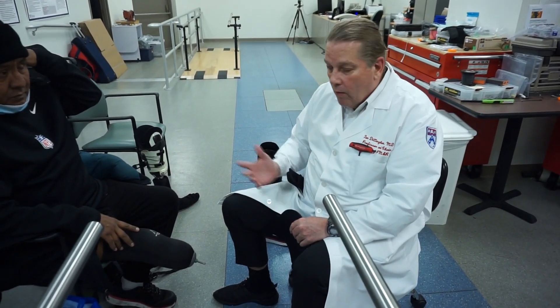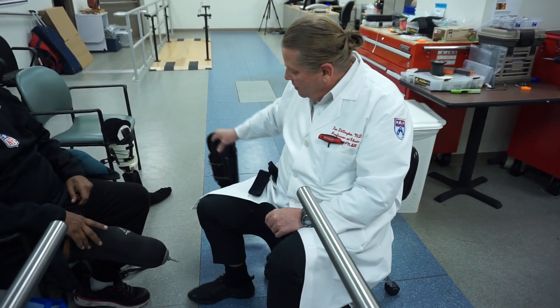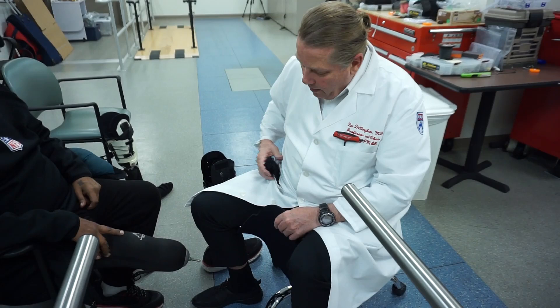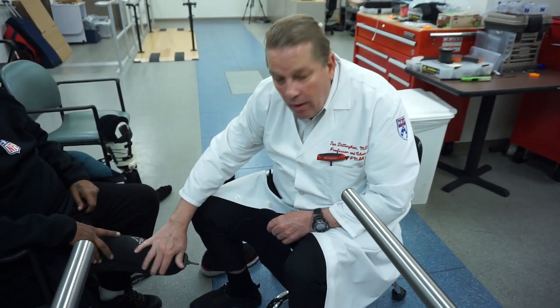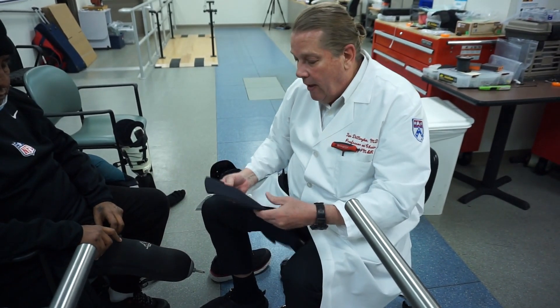We're dealing with one of our prosthetic users of the new iFit prosthetic device. A common problem that patients face is that they may have a bony prominence over their fibular head. We're going to show today how to pad that.